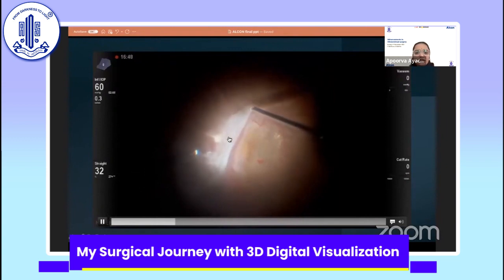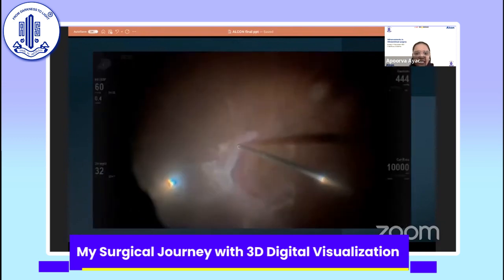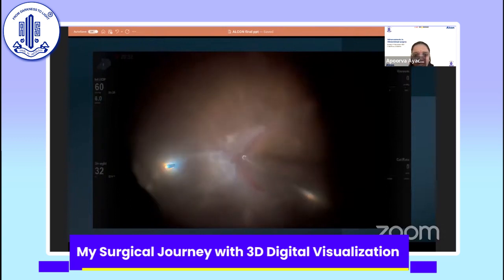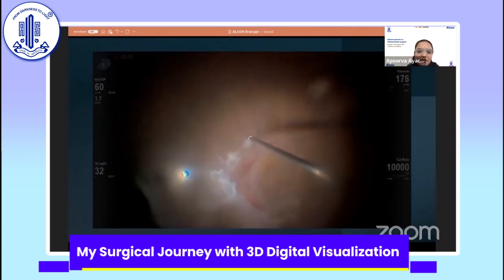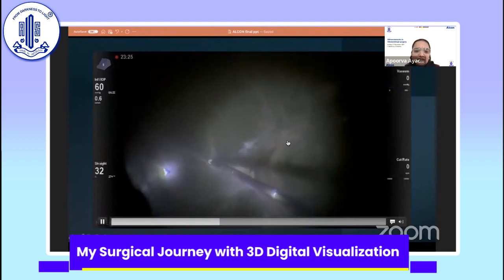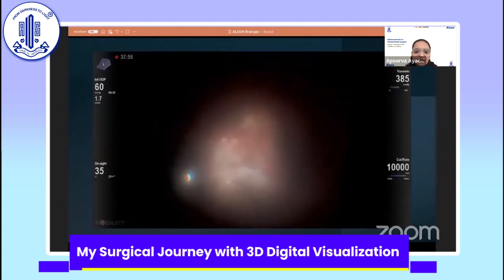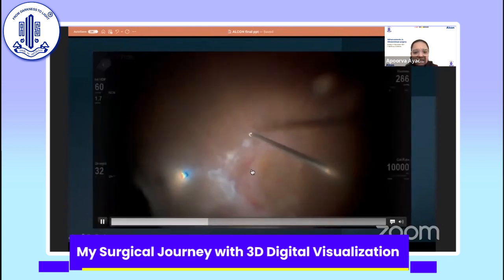I'm using the cutter to create a cleavage. I'm not using much traction. I'm not pulling too much, being careful all the time. I'm just trying to cleave my way with the cutter itself. And once it gets raised a bit, I'm cutting it. Like Dr. Rajiv and Dr. Chakraborty have already shown, these cutters are very high speed and have a low sphere of influence, which allow us to do a very precise surgery.